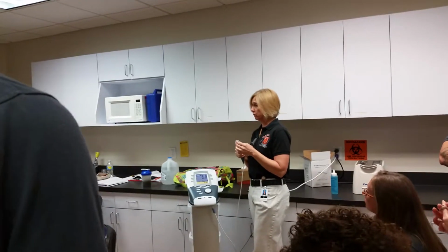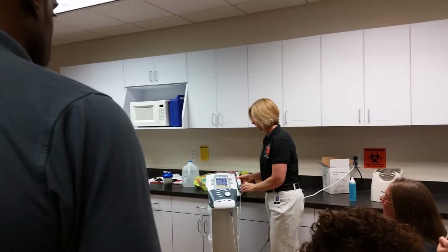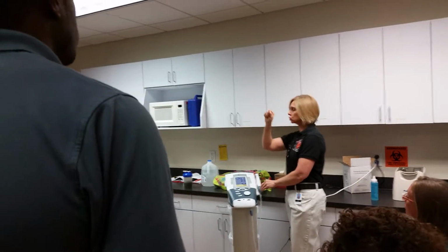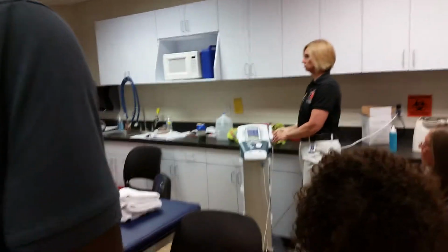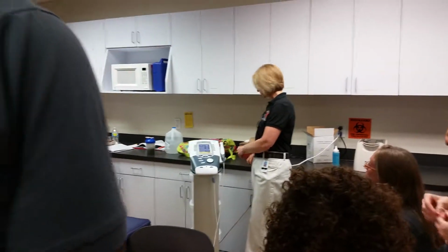Okay. There needs to be 50% overlap in your application area. So whether you use a horizontal stroke or circles, there always needs to be 50% overlap for each consecutive circle or stroke that you do, okay, in order to do an effective application.